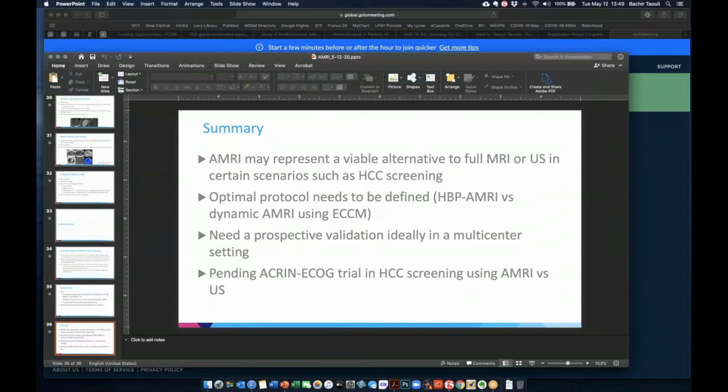Thanks first for this astonishing lecture. It is very informative. But we had 2 lectures concerning ultrasound and contrast enhanced ultrasound, which displayed very informative images and results. We were astonished to the degree that we thought we can replace CT and MRI with contrast enhanced ultrasound in some cases. My concern here: did these studies compare the MRI to ultrasound done by expert radiologists, and after using contrast enhanced ultrasound, or what?